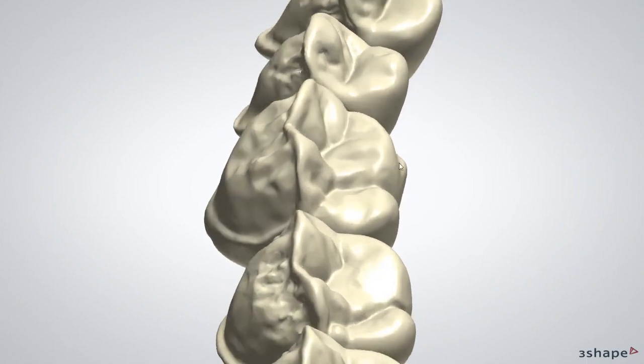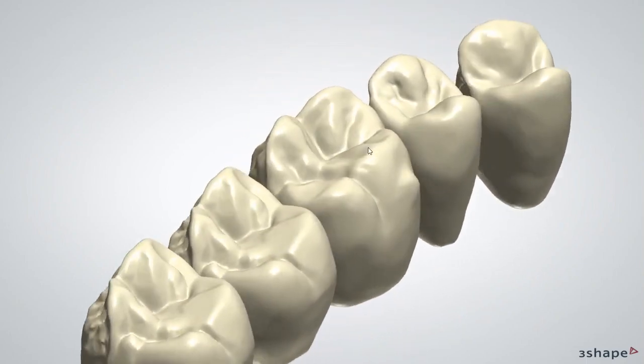I tried all of these three methods, and I even created my own full contour library out of my own teeth. So what I did, I took an impression, I separated each tooth, I added a little bit to the contact, scanned it in, and made a full contour library. So you can do the same. It looks really pretty, and it's a personalized library only from you.